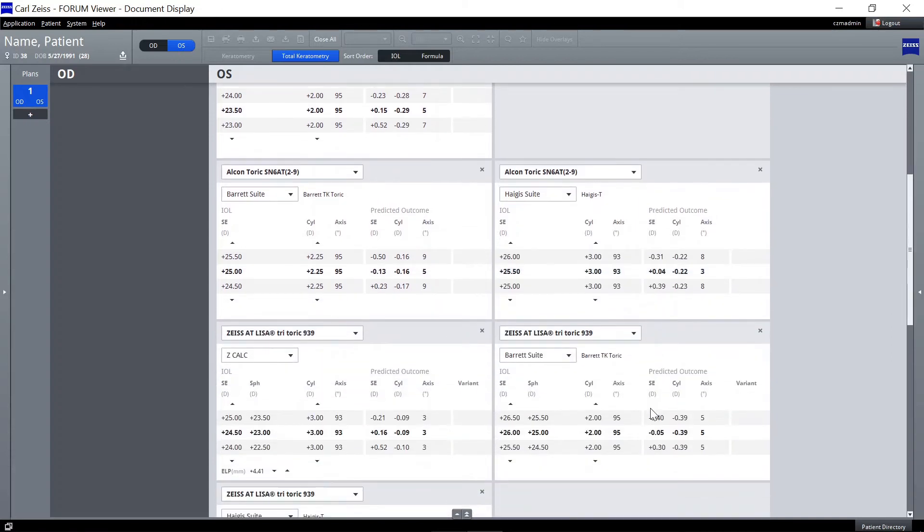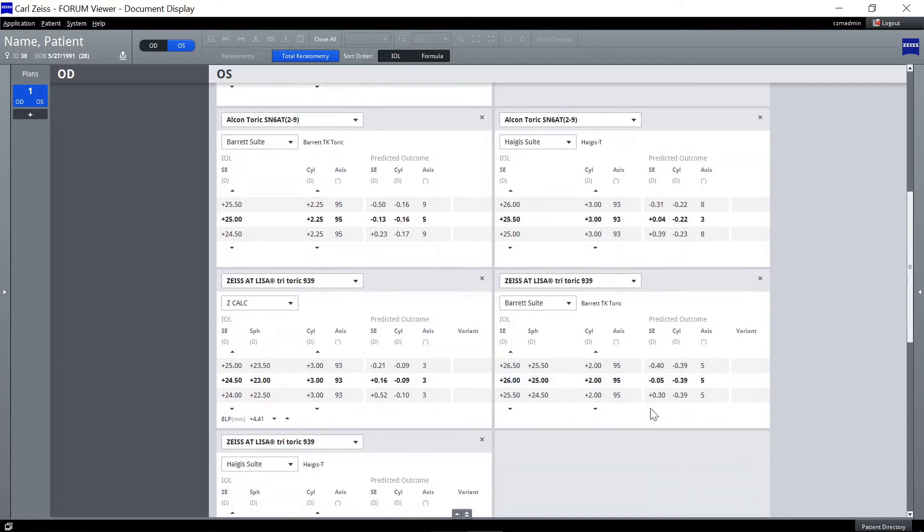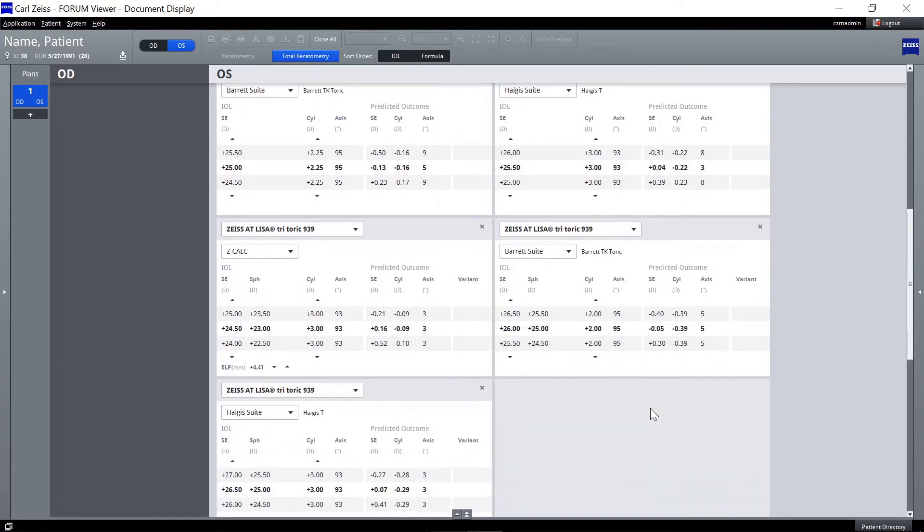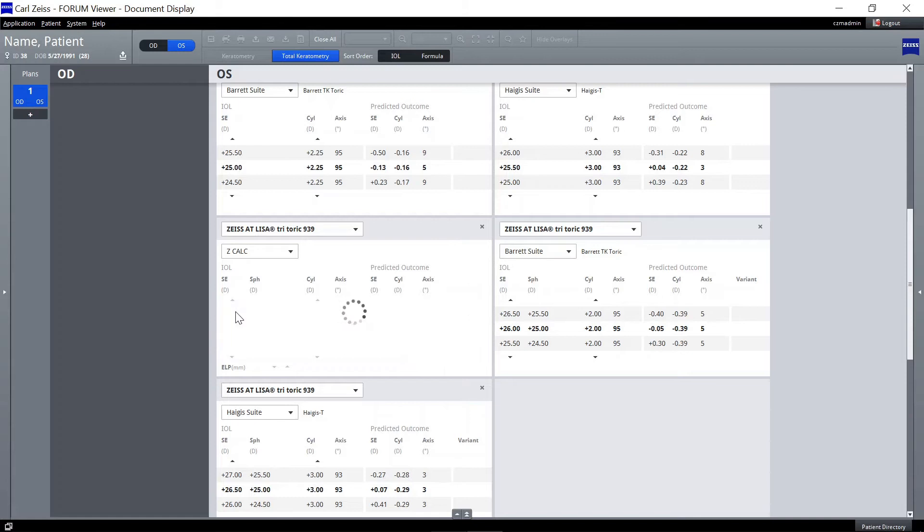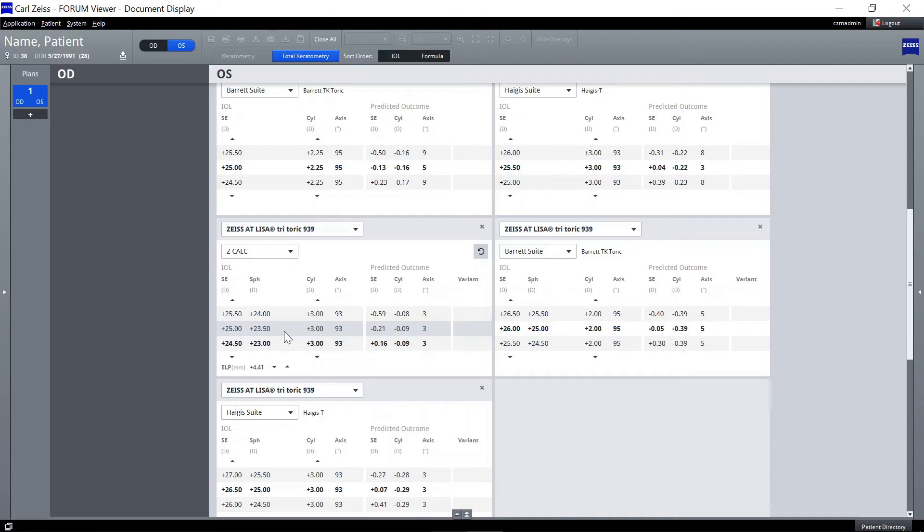If needed, adjust the power of the IOL by clicking on the arrows above and below the respective column. To select the final lens for surgery, click on the IOL.